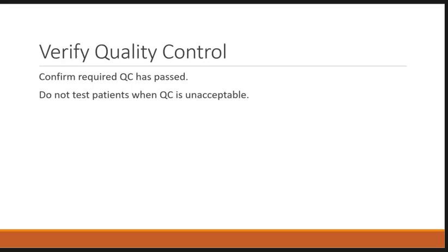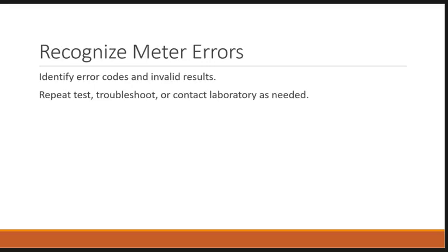Quality control lets you know that your piece of equipment is working properly and that you can trust the results that are obtained. The nurse should review the instrument handbook carefully, understand common glucose meter error messages, and recognize when a test result may not be valid.